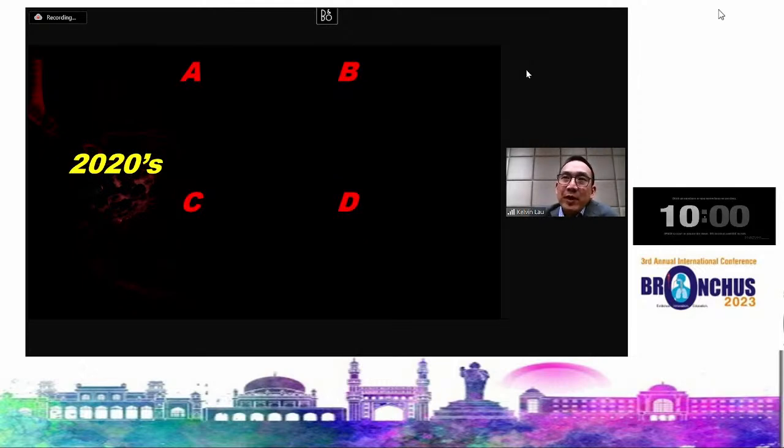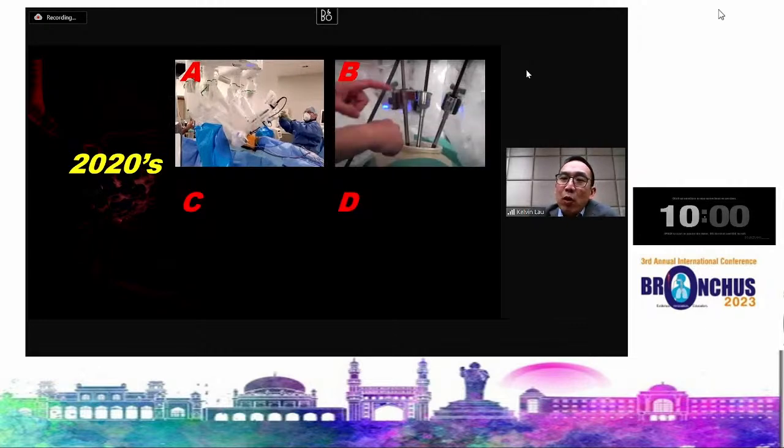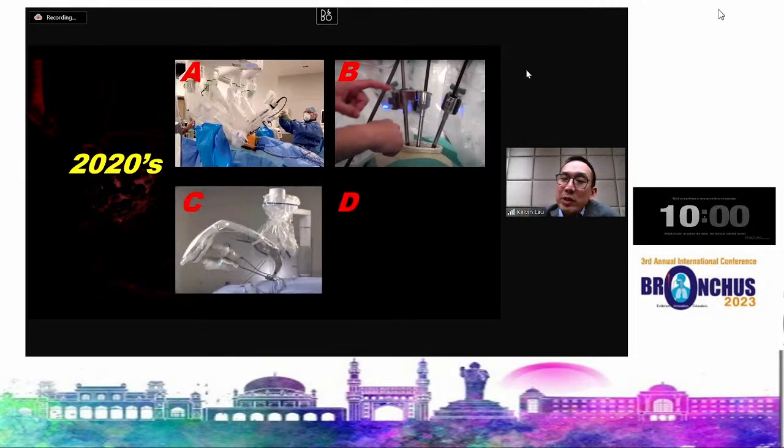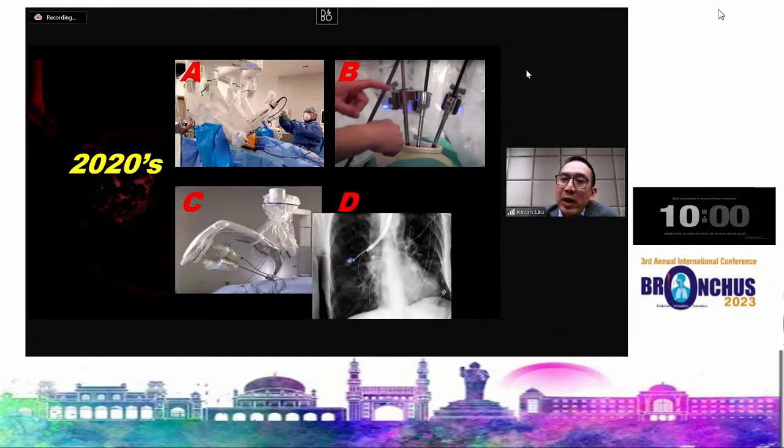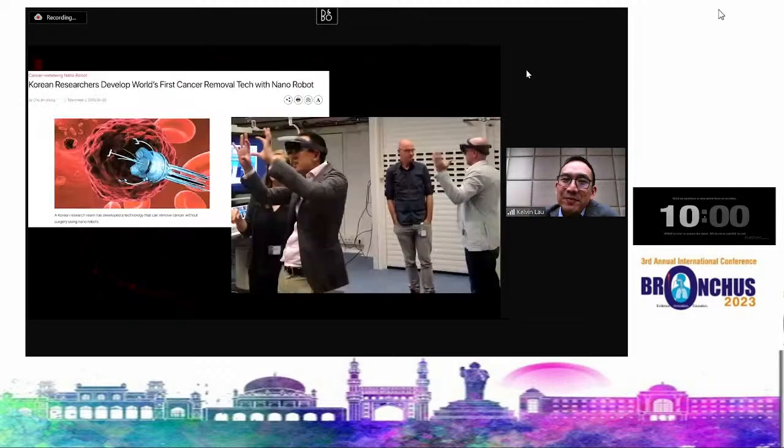So, in summary, looking at the future, we as surgeons are facing nodules that are getting smaller and smaller. Is the future multi-port robotic surgery? A multi-port robot going through a single hole, the way Diego does it? Uniportal surgery going through a single port? Or is it a robot that doesn't need an incision? You have to ask yourself this as a doctor, a surgeon, and as a patient.